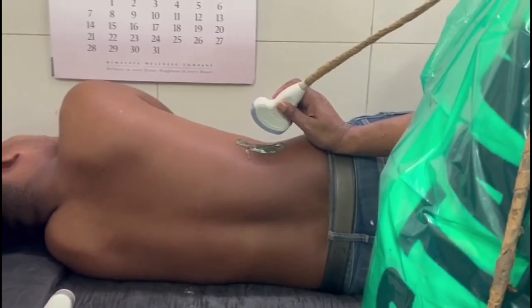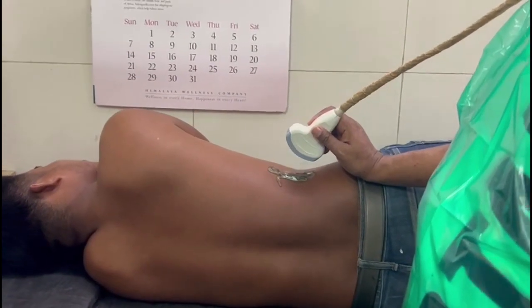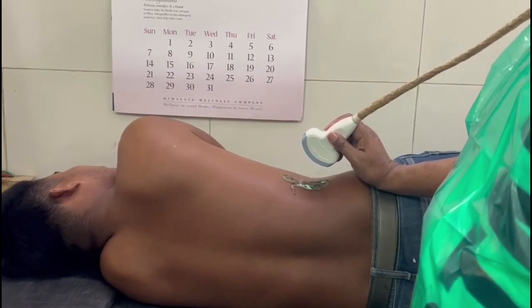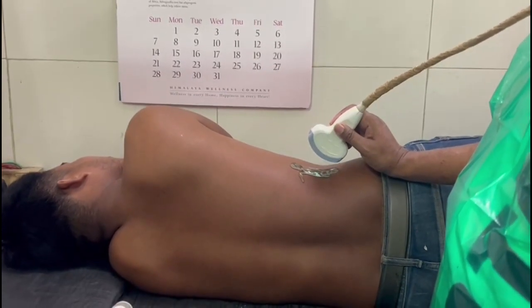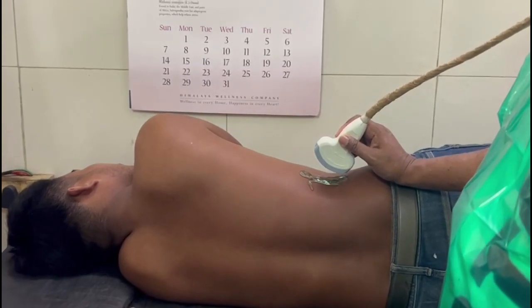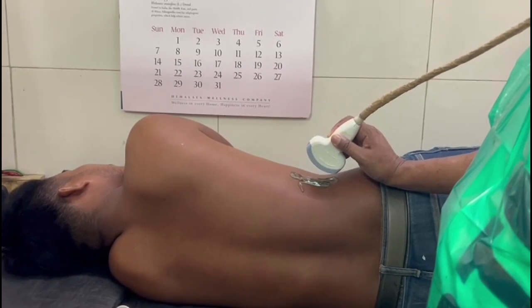Of the KUB region. KUB means kidney, ureter and bladder, urinary bladder. So we shall put my probe on the right side, right kidney. This is the left lateral position.